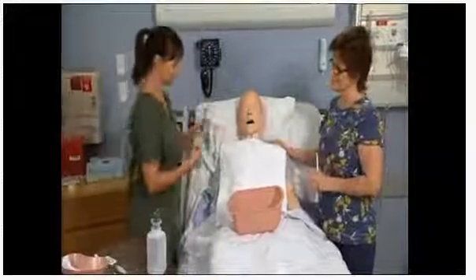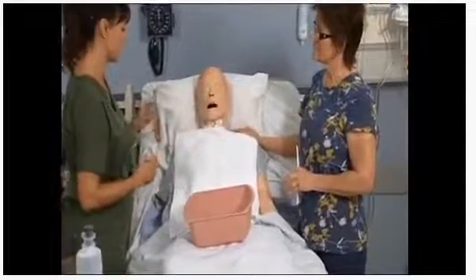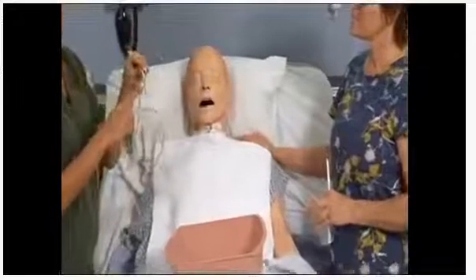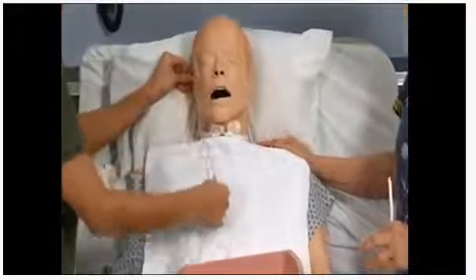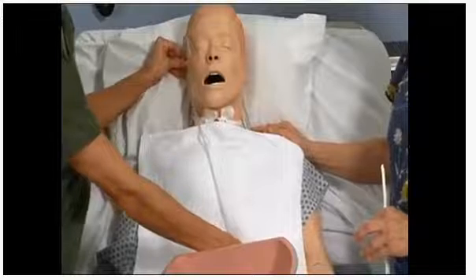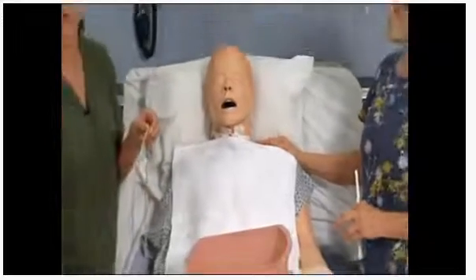The very first thing I'm going to do, Mrs. Jones, is I'm going to measure so I know how far down I need to go to get to your stomach, okay? You want to get the very end that's going to actually go into the patient first. And you're going to start at the tip of the nose to the earlobe and down to the xiphoid process and about 1 more inch after that. Then you can mark your tube. You can mark it with a pen or you can mark it with a piece of tape.